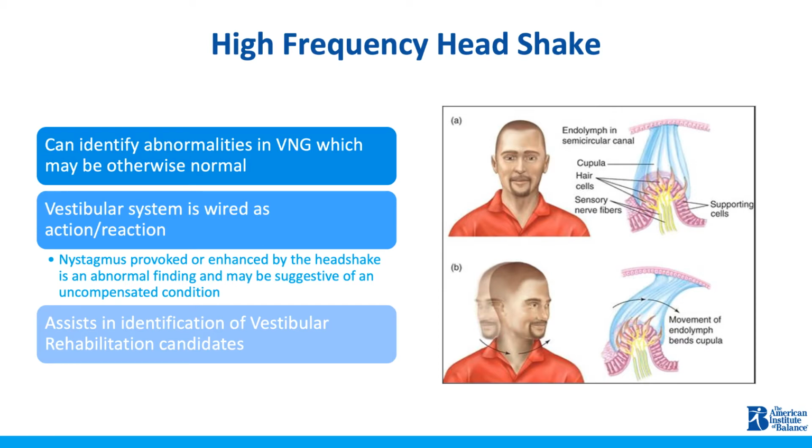In this example, the right ear is the healthy and strong ear. Therefore, the nystagmus will be labeled as right beating, with the slow phase drifting to the left ear and snapping back to the stronger right ear that's giving the vestibular nuclei more information than the left.